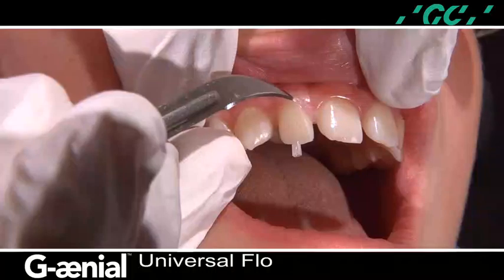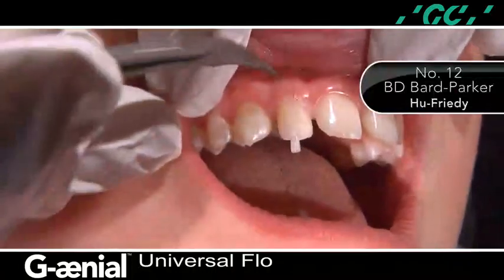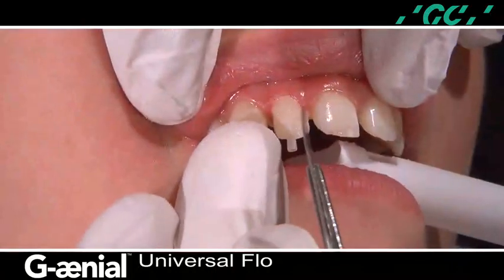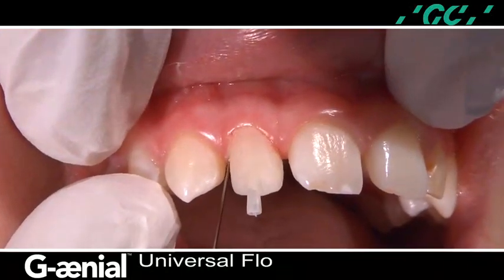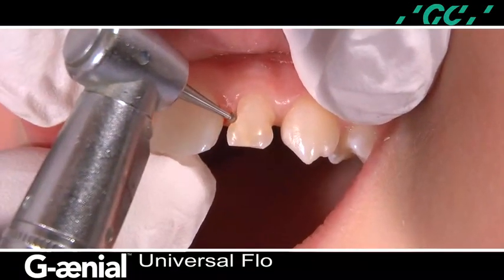The excess polymerized composite resin is removed with a scalpel blade, a number 12 BD Bard-Parker. It is important to prevent tissue laceration, and if necessary, an 8A instrument or a Zerfing can be used to gently reflect the gingiva. The same procedure is accomplished on the maxillary left lateral incisor.